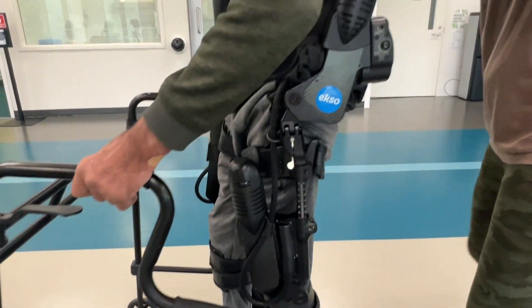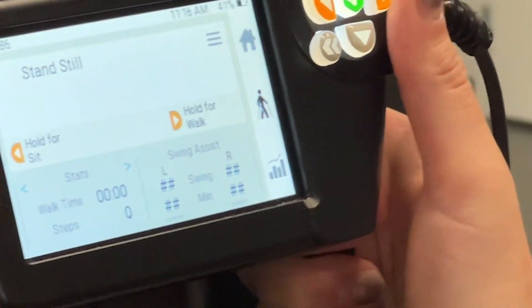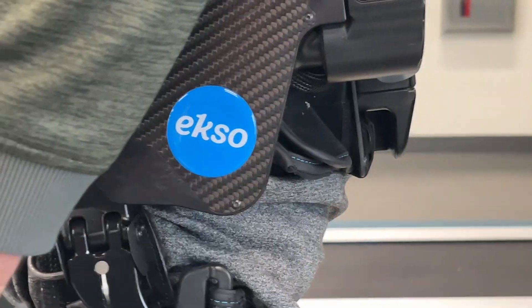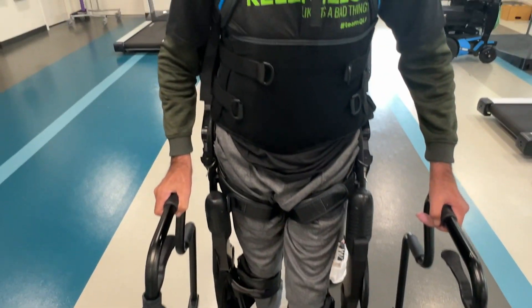Now let's go check out the exoskeleton — this is something I personally use. It was the first time I was able to walk and stand since my injury. Hi everyone, I'm Danny and I'm a PT here at QLI. Hi, I'm Richard, a resident at QLI. This is our exoskeleton device that uses robotic technology to allow us to get our residents up and walking with good mechanics before their body may be able to do so on its own. And it feels great when you get up and walking like this.